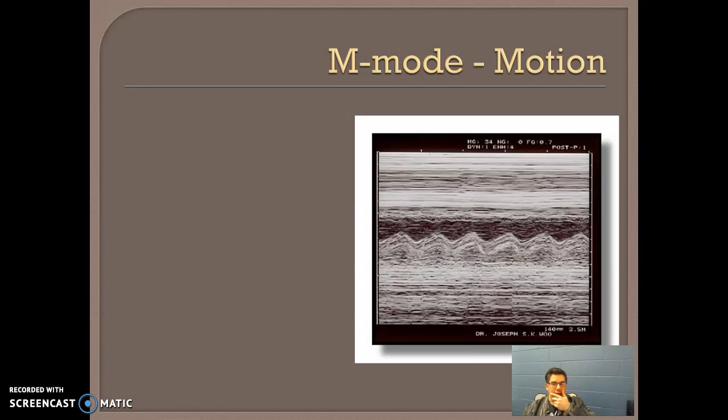And you can see that certain layers, certain reflectors rather, along the line are not moving, nice and static over time, and certain ones are. So this could be a valve or some structure that is moving periodically. And you could even over time map out those oscillations, and you could figure out what the period of oscillation is, right?